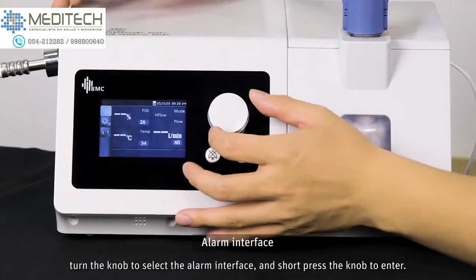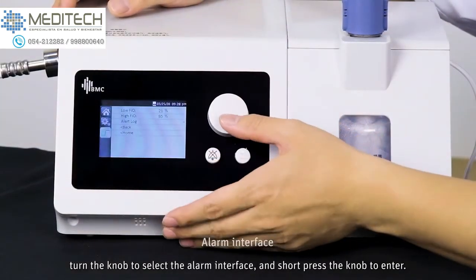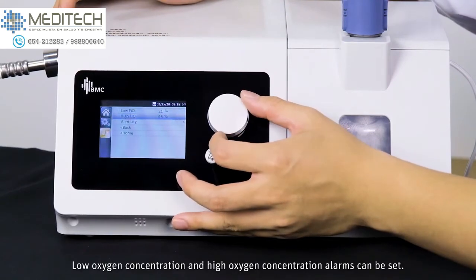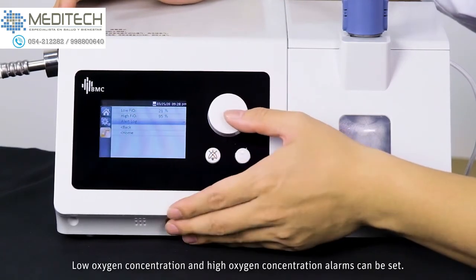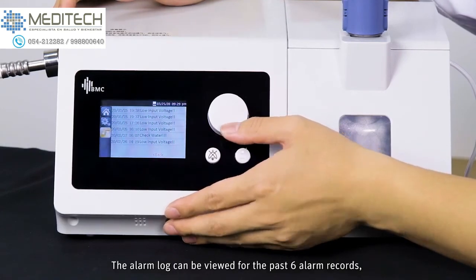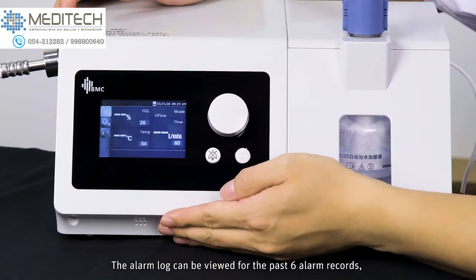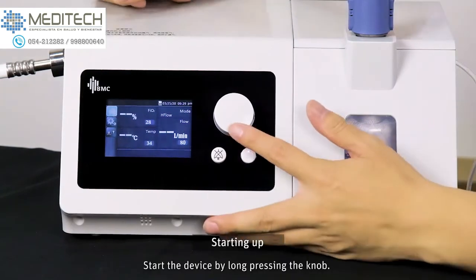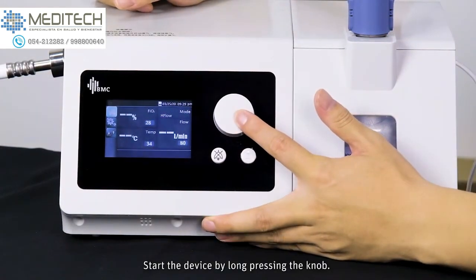Turn the knob to select the alarm interface, and short press the knob to enter. Low oxygen concentration and high oxygen concentration alarms can be set. The alarm log can be viewed for the past 6 alarm records, which is convenient for the medical workers to learn more information.